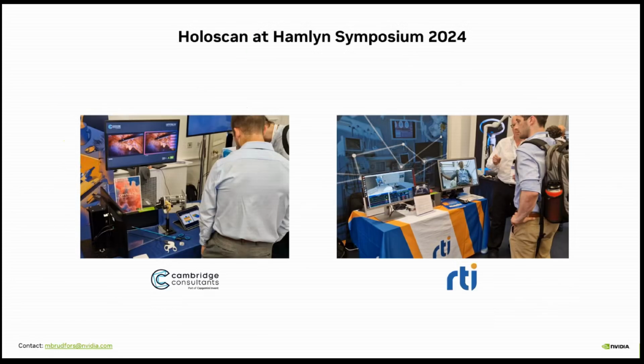Talking about Cambridge Consultants, maybe you didn't notice it, but two of the demos shown during the Hamlyn Symposium actually used Holoscan SDK and this IGX dev kit. It was the demo by Cambridge Consultants, where they ran a bunch of different AI models to, among other things, provide super resolution of surgical video. Here you see the IGX Orin box that runs Holoscan SDK. And on the right, we have RTI, represented by Darren in the back, who did another application. You also have an IGX Orin here, where they use DDS to pass data between the IGX Orin, a laptop, and I think a Raspberry Pi, and the AI inference was running on the IGX Orin.